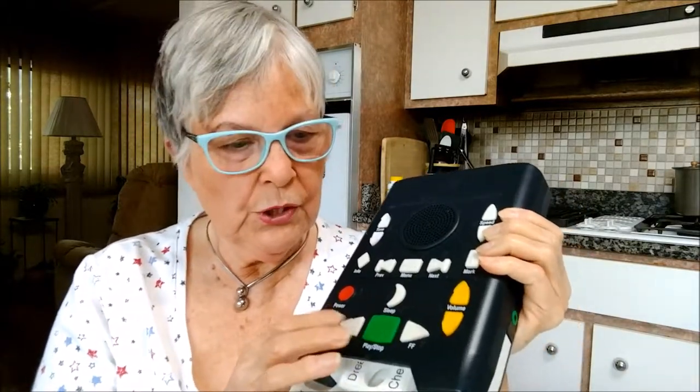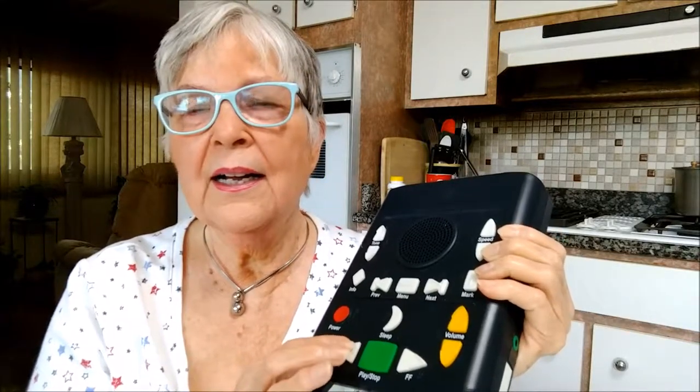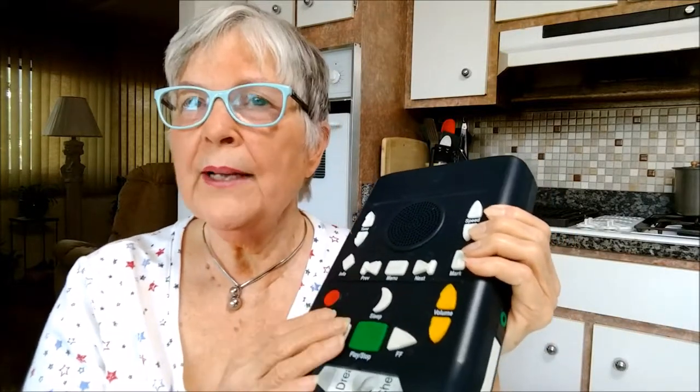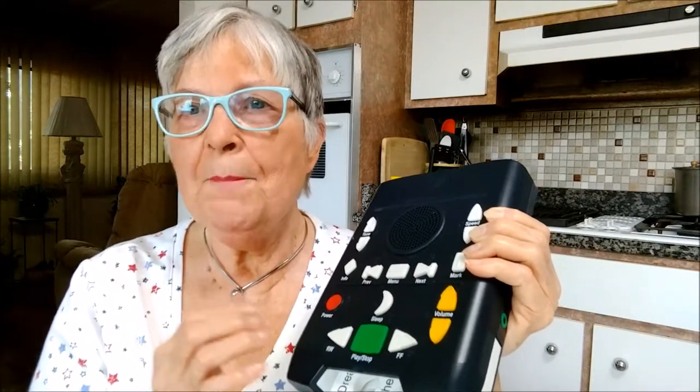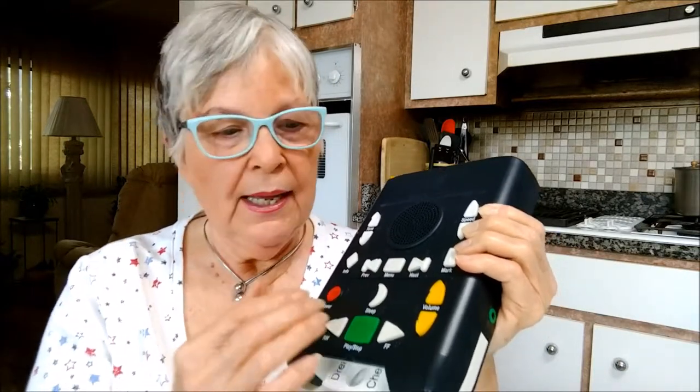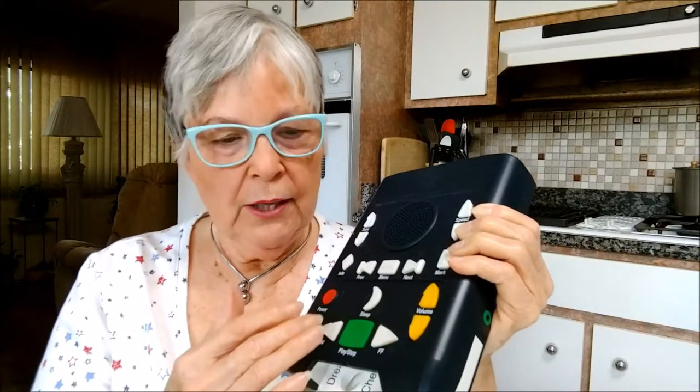Many times when you've stopped the player, you don't quite remember where you are. This button lets you go back: 20 seconds, back one minute, back five minutes, back 15 minutes, and then back by chapter. Or, if you've gone too far back and want to fast forward: forward 20 seconds, one minute, five minutes, 15 minutes, by chapter.